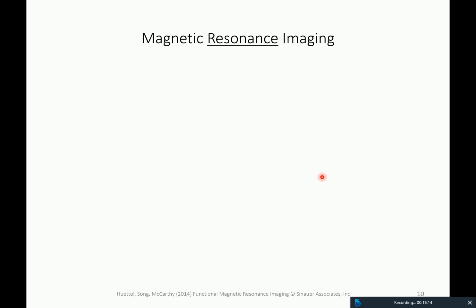So why then resonance? Resonance relates to the fact that there are these radio frequency coils that excite atomic nuclei. Radio frequency coils are basically something like what's in your microwave at home.